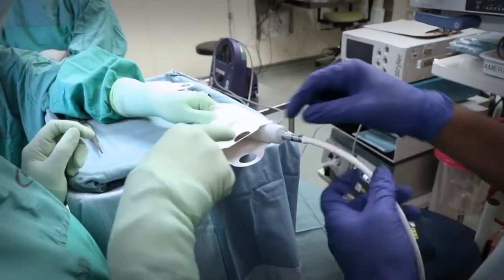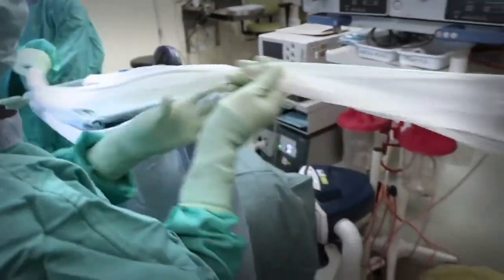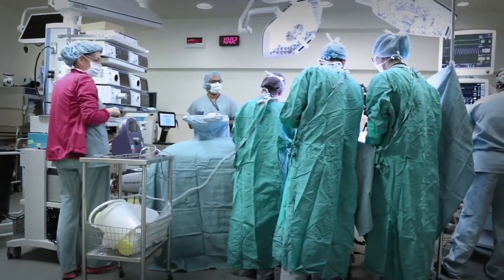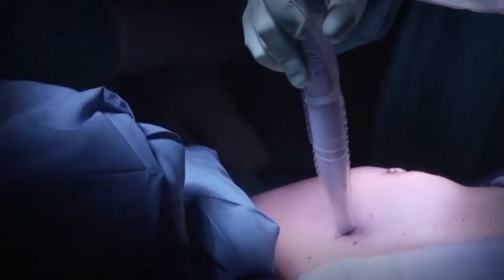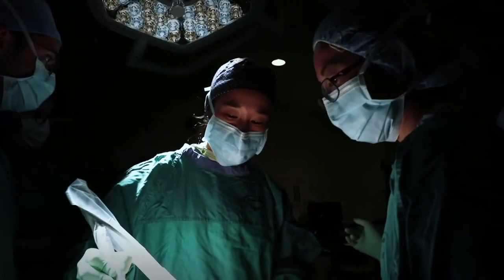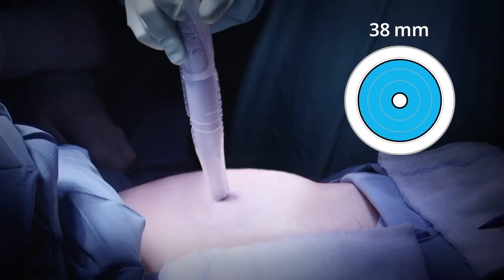On the day of surgery, the surgeon and the surgical assistant prepare the MOLLE wand and the system. A MOLLE-guided lumpectomy takes place in a standard operating room. With the patient under anesthetic, the surgeon uses the MOLLE wand to locate the MOLLE marker inside the tumor before making an incision. The MOLLE tablet tells the surgeon the distance to the MOLLE marker through real-time audio and visual feedback options.